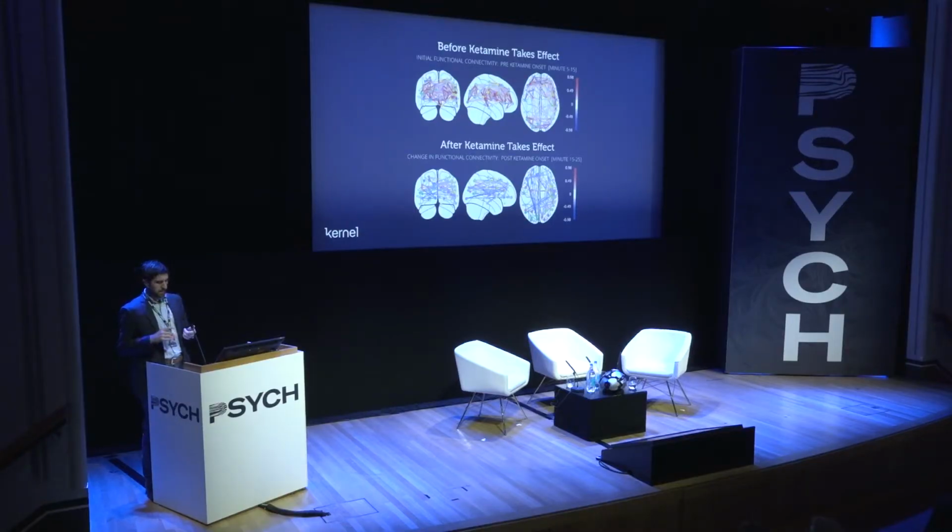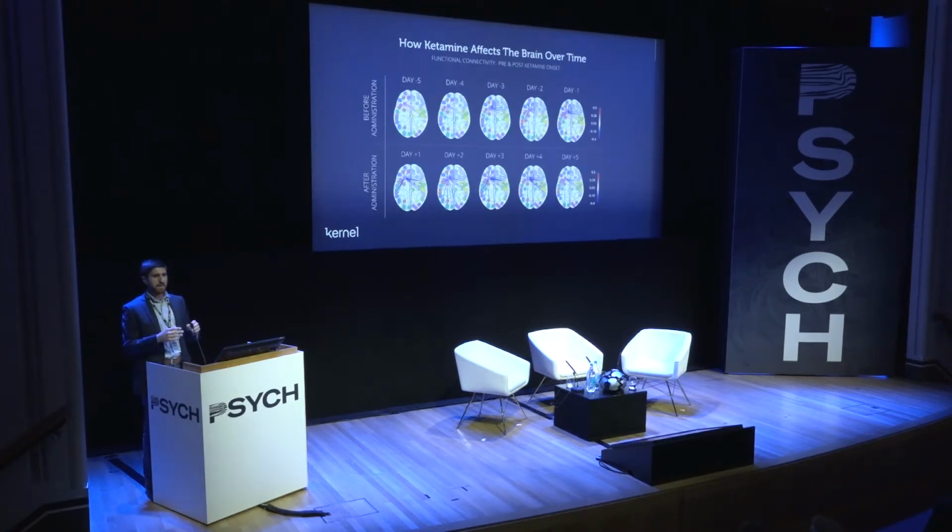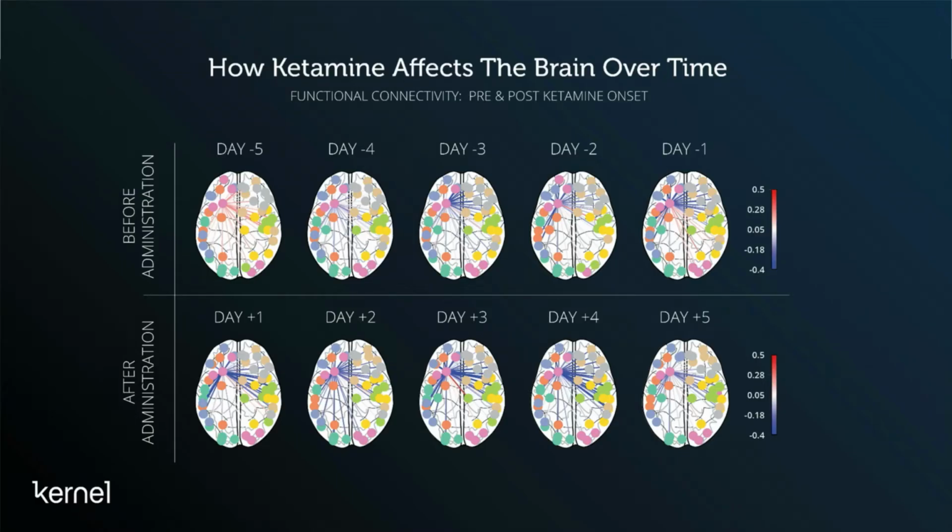So specifically, it's been shown that there's some activity in the default mode network that gets suppressed due to the effects of ketamine. If we look at the longitudinal data, the top pane shows the 5 days before. And what you can see here is that the functional connectivity of this person during resting state is relatively stable day to day. There's a little bit of fluctuation, as you would expect from being measured on different days, but overall, it's pretty stable. What you see on the 5 days after ketamine is that there is a decrease in functional connectivity, specifically in one particular ROI, which is related to the dorsal nexus. And I'll show you a little bit about the coupling between that node, the dorsal nexus, and the default mode network in a time course. But what your takeaway here is that we see a measurable change in the brain that lasts for a few days after having the ketamine dose.